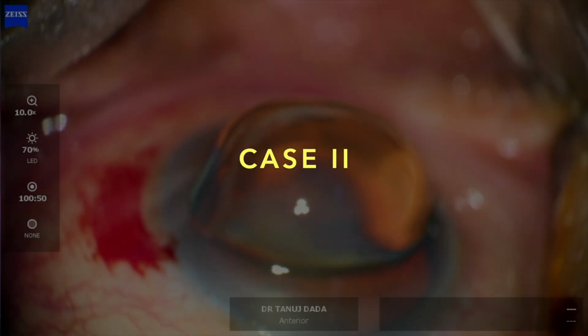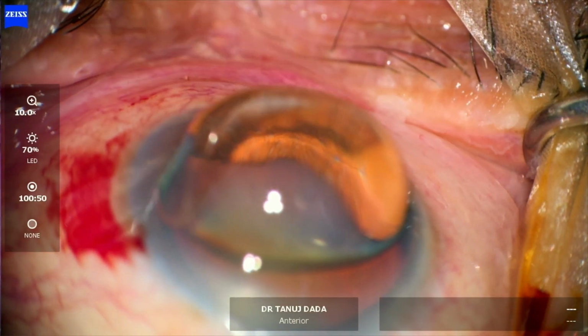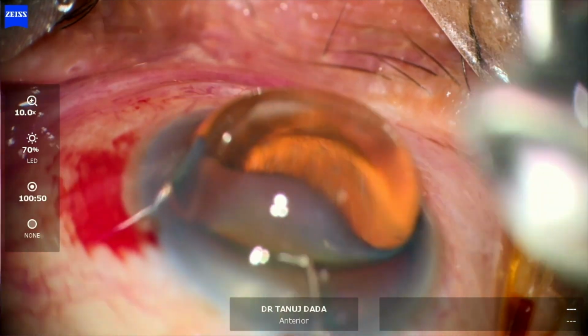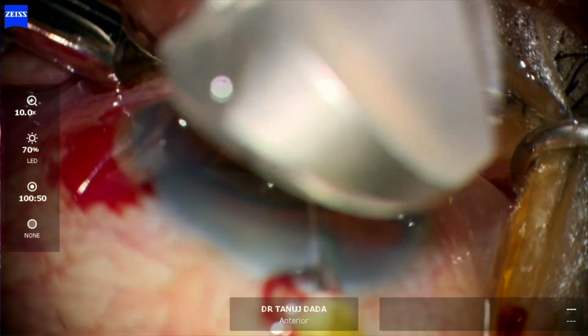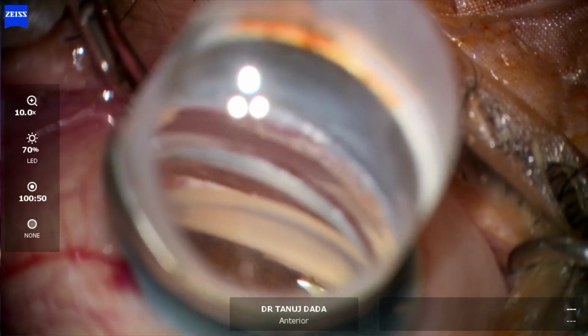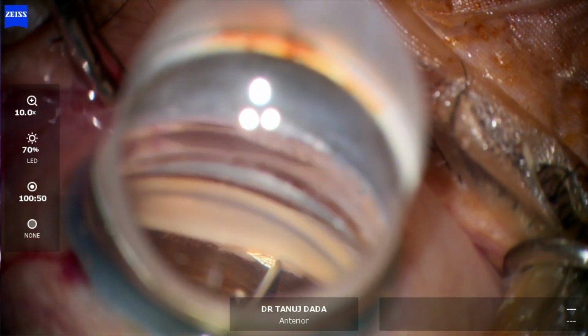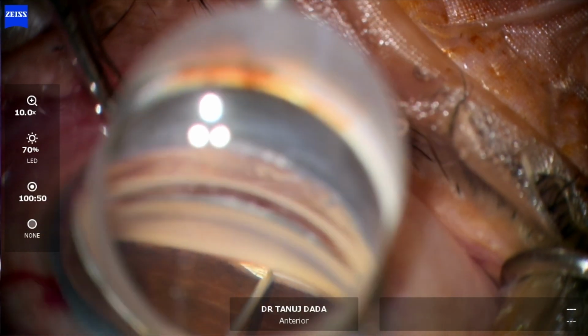Here is another case demonstrating the technique of Visco-BANG. After identification of the trabecular meshwork, the Visco-BANG can be performed as demonstrated.